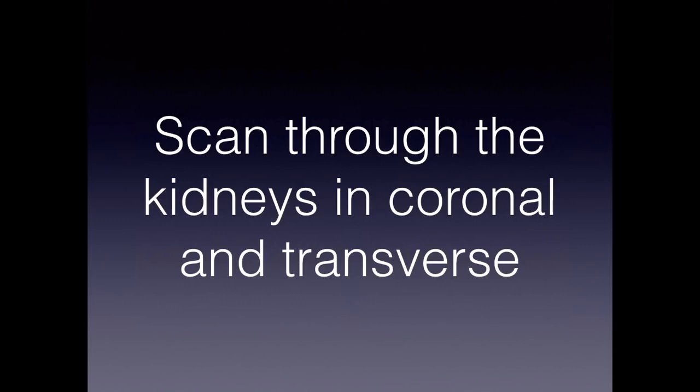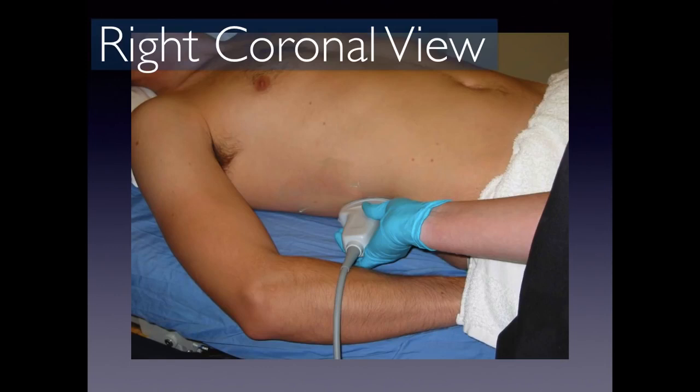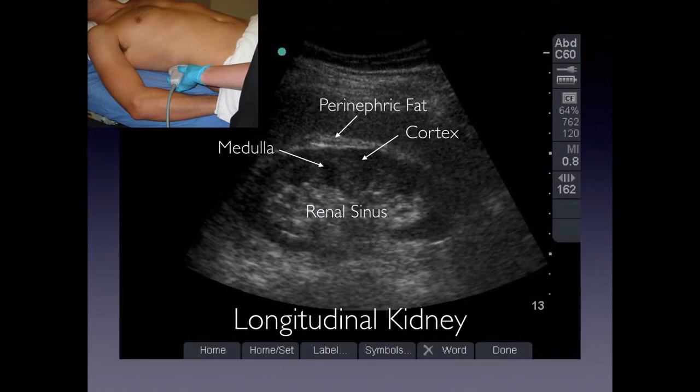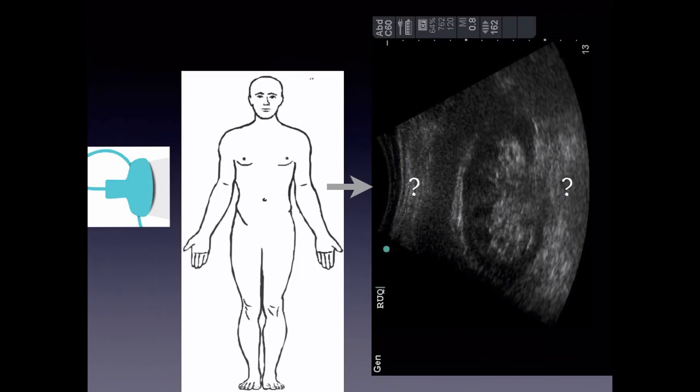You want to scan through the kidneys in coronal and transverse views. For the right coronal view, the indicator is up towards the patient's head to get a longitudinal image. You can see the perinephric fat, the cortex, and the medulla which is slightly hypoechoic to the cortex, and the renal sinus appears bright.